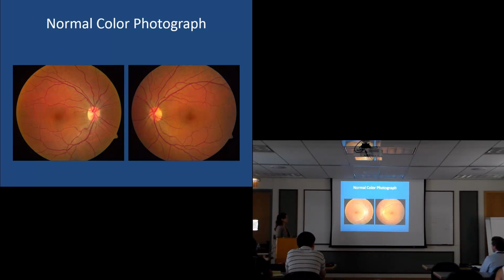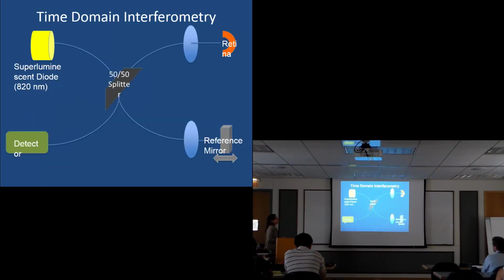The challenge is that the arteries and veins have a lot of diseases that we can recognize daily, from diabetes, high blood pressure, and we can diagnose that by looking at the patients, but when there are problems in the vessels, they're right next to the retina, and so it can destroy the neurosensory tissue that makes the image in the brain. So this was very limited until they developed time domain interferometry and the OCT device that helps us to get the signal. Because the challenge always was, what depth were we looking at in the retina? How do you resolve that two-dimensional image to see where depth is?